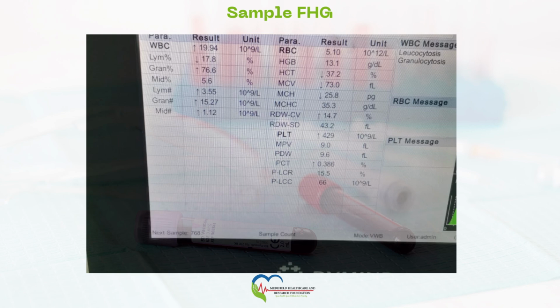There has been a long-term problem in absorbing nutrients, the iron. So there is iron deficiency, and there is both folate and vitamin B12 deficiency, because those responsible for macrocytic anemia are not being absorbed, and those responsible for microcytic anemia are also not being absorbed. So we have both microcytic and macrocytic cells. This tells us that this patient could be having a GI issue as well, and the gut is not having proper absorption.